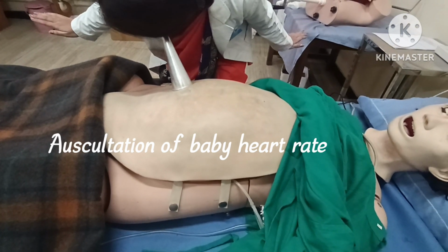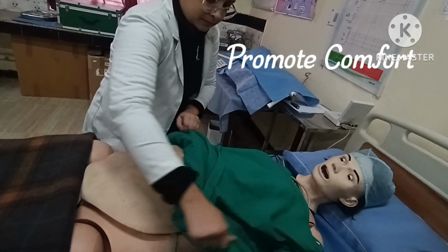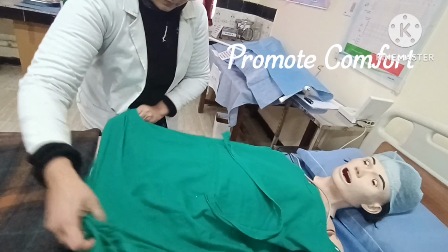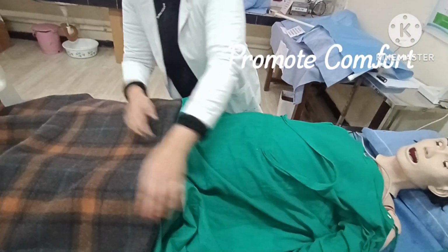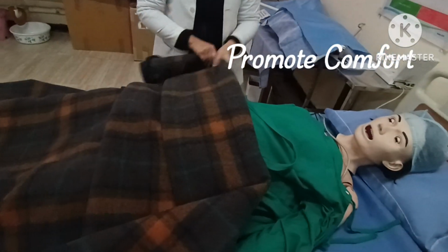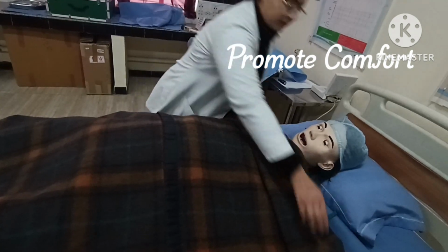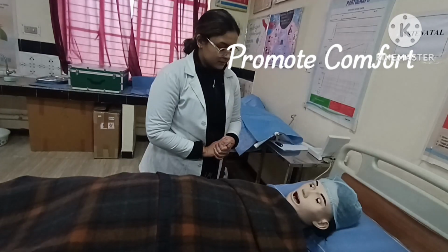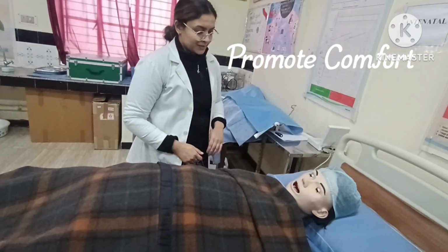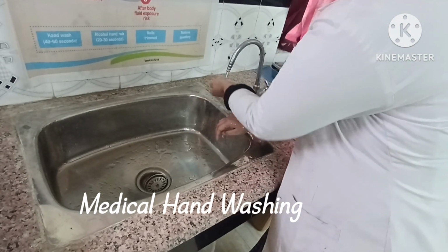For auscultation, place fetoscope or stethoscope over the convex portion of fetus closest to the anterior uterine wall. Redress the woman. Make her comfortable. Inform the mother of your findings. Replace articles and wash hands.